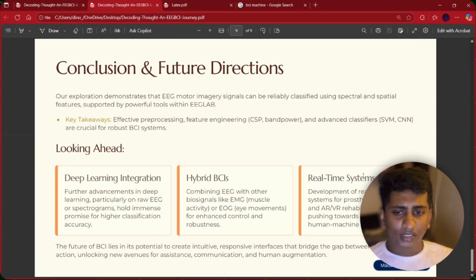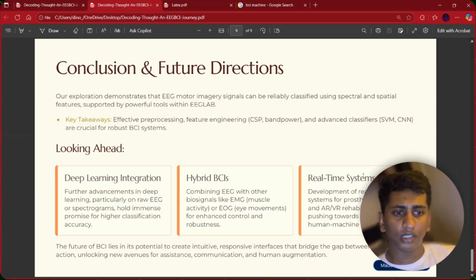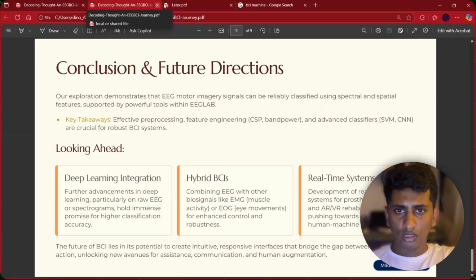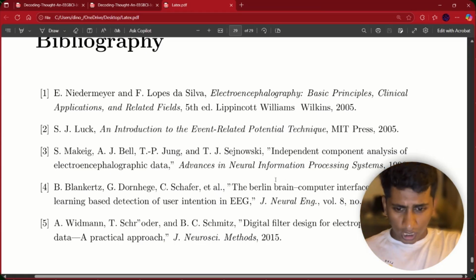But yeah, once anyone miniaturizes BCIs and all, that will be different. So yeah, in future it will be a big thing. So I think it makes clear an idea of what we will be doing. So yeah, I'll be sharing these files, and now let's go for the demo.